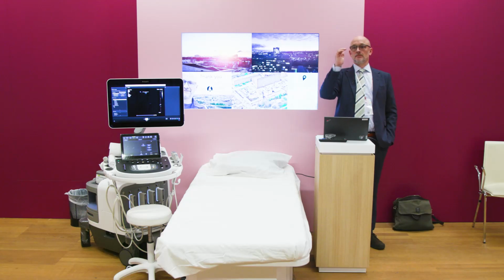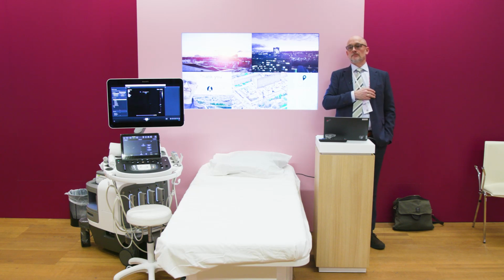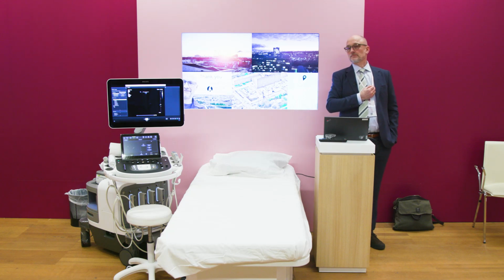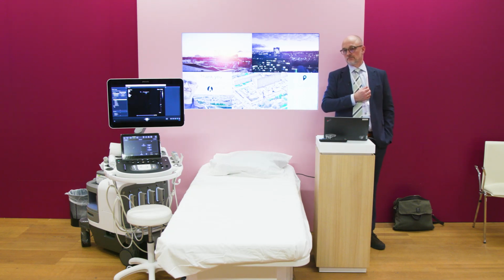Any questions, please? Yes? Have you tried the method on the complicated patients, meaning overweight, because I imagine it affects the visibility of the 3D scan? Actually, the experienced sonographers and physicians who do the complex patients use the AAA model today as a kind of mentor. So if they're a little bit in doubt, is this right?